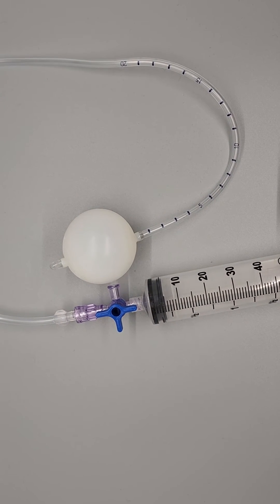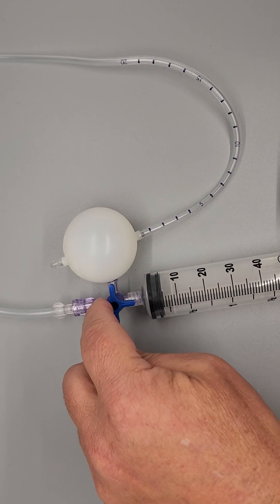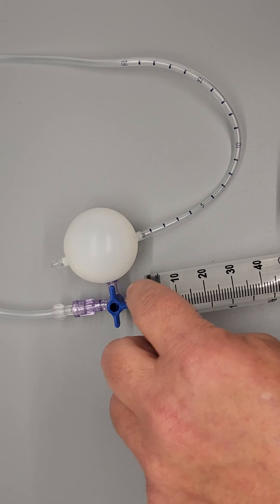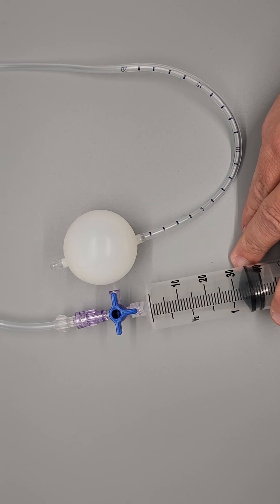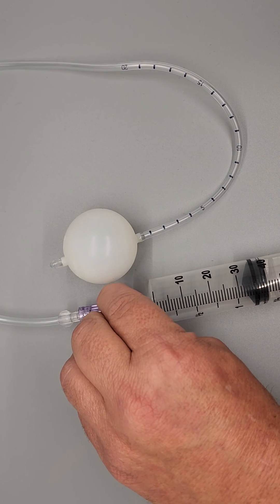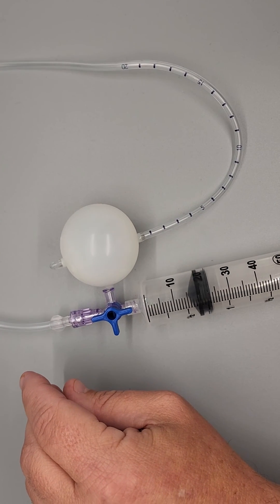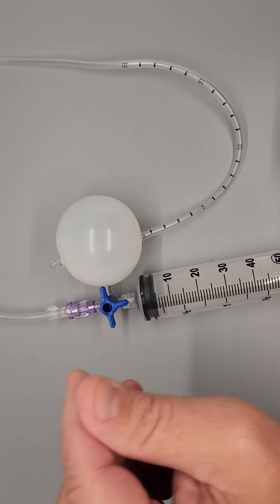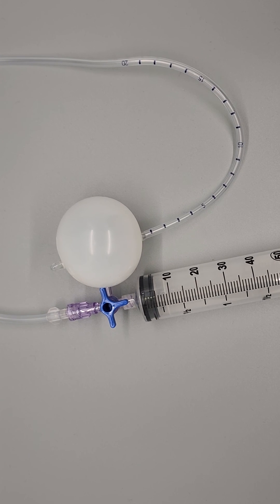Now if I want to add more air, I'm going to turn my stopcock so I'm blocking the catheter. Now I'm opening up my side port so that I can draw more air into my syringe. And again, I'll do it one more time — I'm going to block off my side port, and now I'm going to push more air into my balloon. And that's as easy as it is. That is how we use the new stopcocks here at CMT. Thank you.